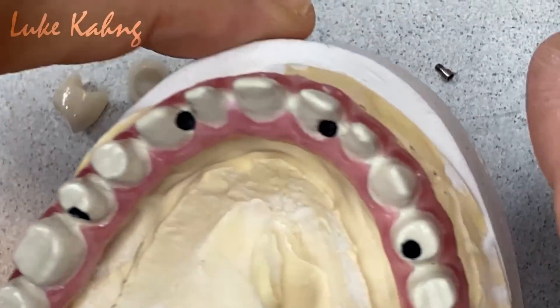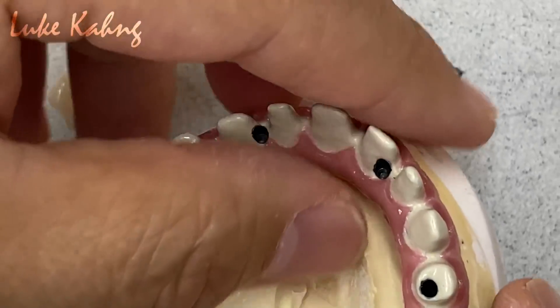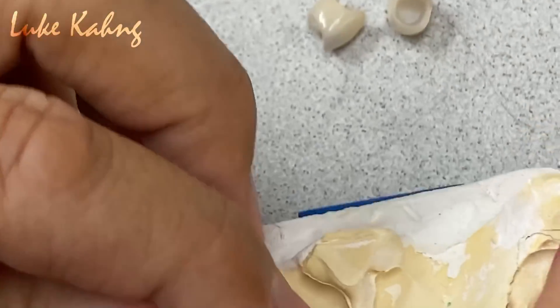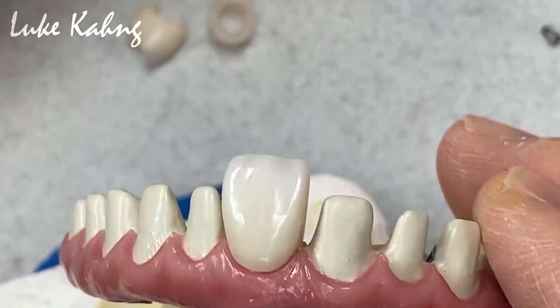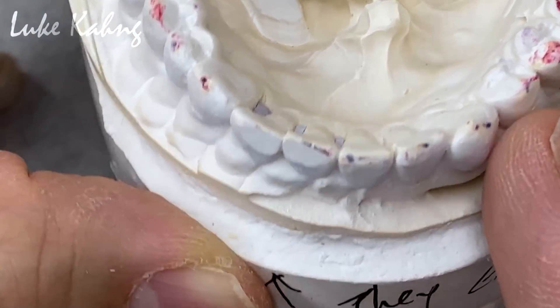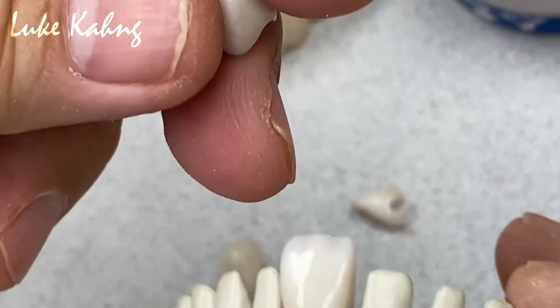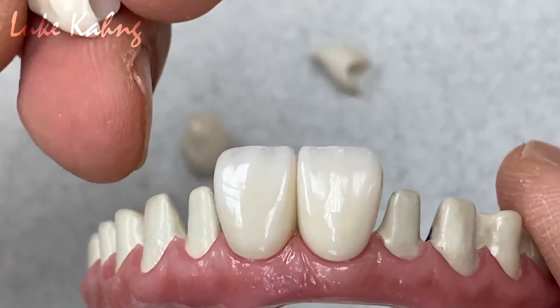You saw all our video — we designed it and specifically designed the tissue contour, size-wise, everything. Then on top of that, we made the restoration monolithic. Why? Because the lower teeth — the fake teeth — will crack easily. So we're going to cement with this soon.